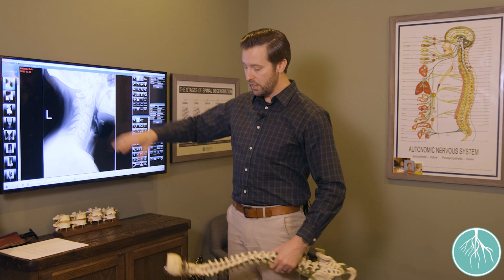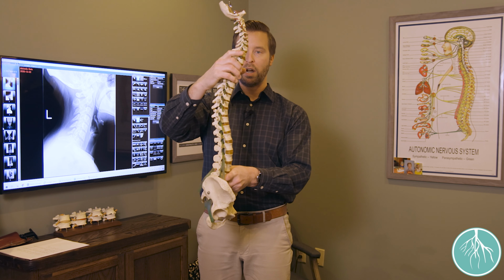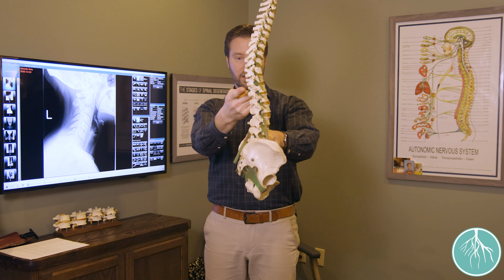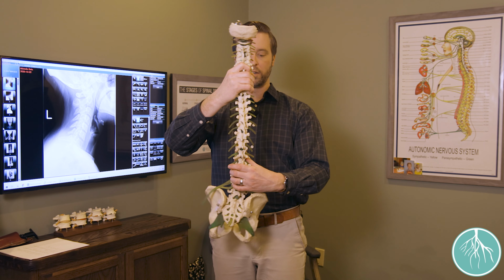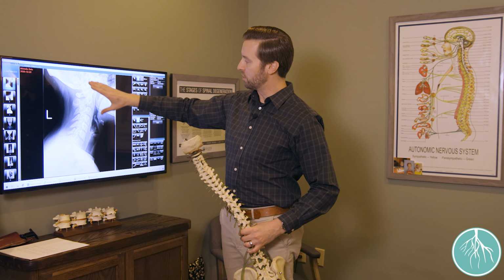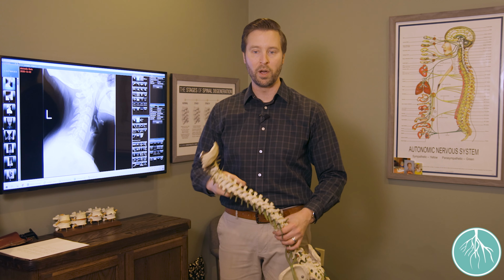So let's go a little further into what an example of an X-ray looks like and what we should be seeing on these spinal X-rays. So first of all, this X-ray here is of the side view of the neck. From the side of our spine, we should have some proper curvatures. We should have a curve in the neck, a curve in the mid-back, and a curve in the lower back. And it looks like a mild S, so we call it the S curvature. Then from the back of the spine, or a straight-on view, I say it should be straight as an arrow, should be straight up and down. So with this being a side view of the neck, we're looking for a C-shaped curve in the neck. That's the first thing I'm looking for right away.